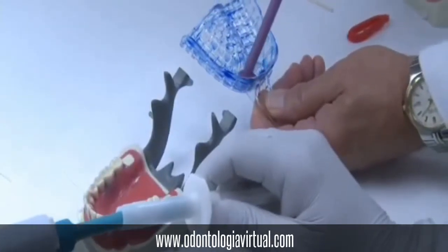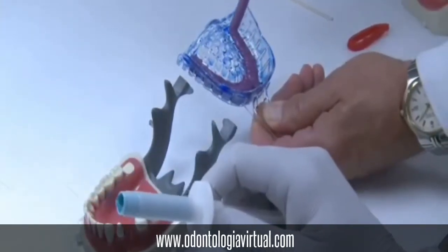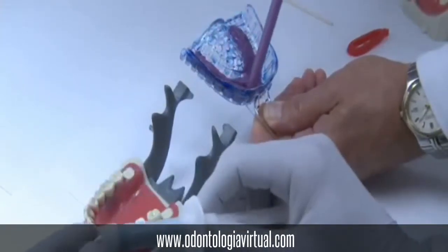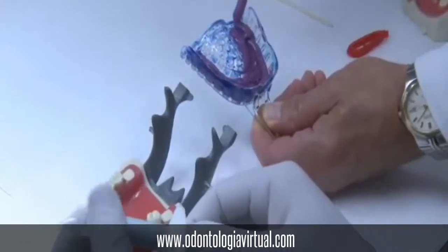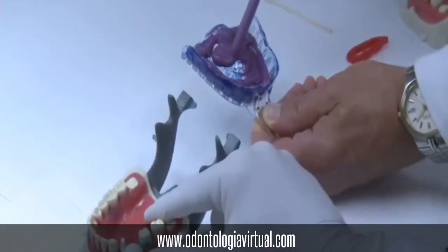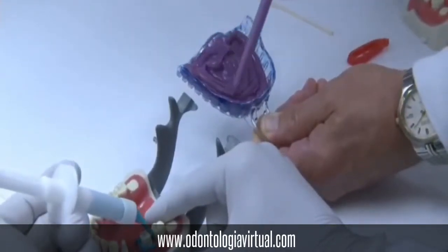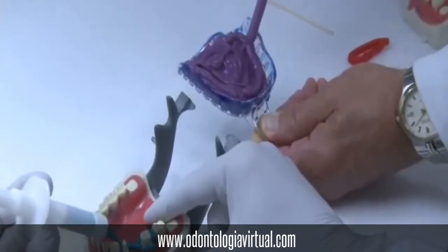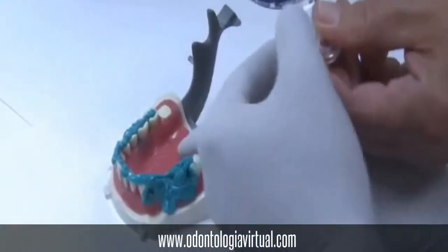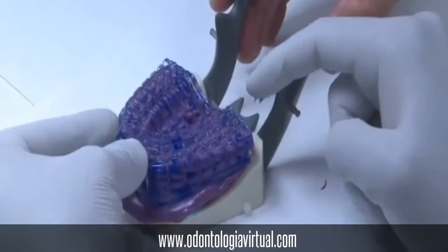Working in pairs, have one person load the impression tray with the Monophase impression material, while the other person injects the Aquacill around the preparations. Begin by placing the tip of the impression gun interproximally with the tip in contact with the tooth and in close proximity to the margin. Cover the entire axial surfaces. Do not lift the tip off the tooth and do not stop the injection. Once you have that, place the loaded tray over the teeth and seat it. Hold the tray until set.